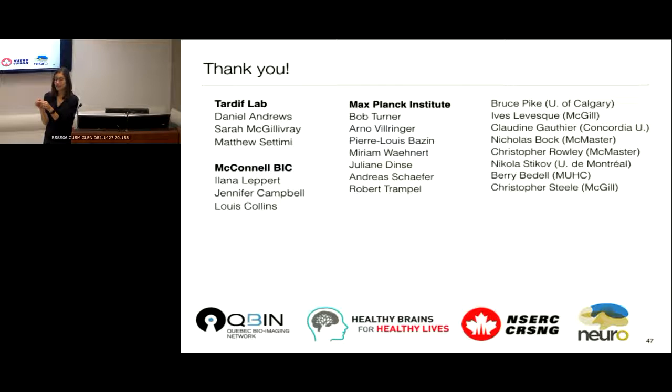What's nice is that they can acquire those navigators and choose to either update the field of view or not update it. So effectively, they have an index of subject motion. They did this in subjects and then looked at the impact it could have on group analyses of cortical thickness, gray matter volume, these types of things.